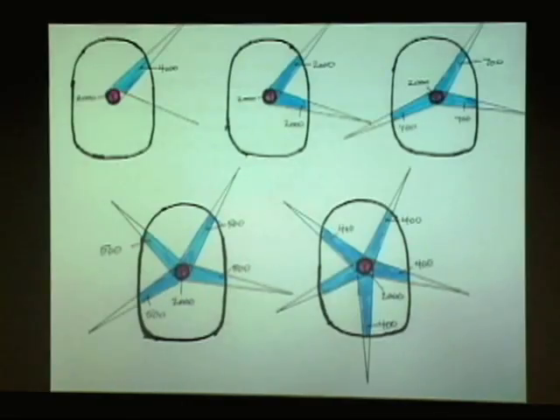All right, so this is a professionally prepared slide, you can see. And this is what I do with my patients when I try to explain how Gamma Knife works, so kind of follow along with me. The way radiation enters the body, it actually starts being absorbed to a certain degree. And in this, this is supposed to be a skull, and this is one beam coming in.